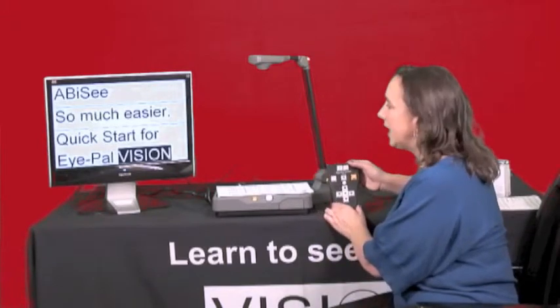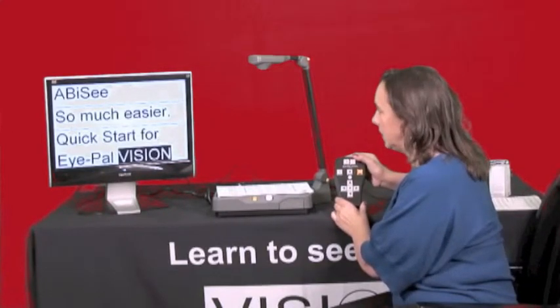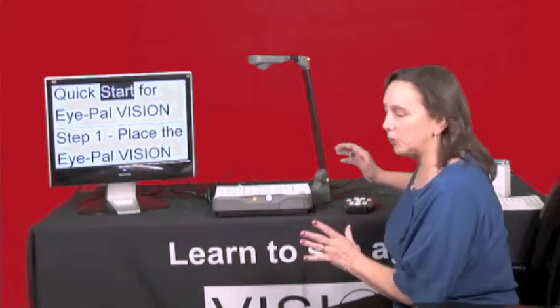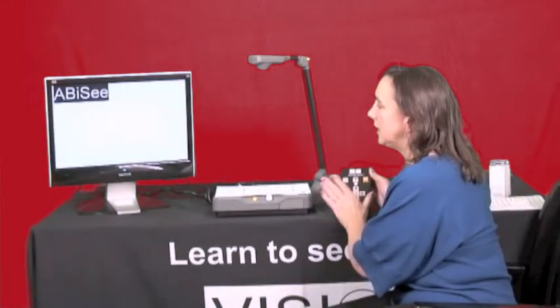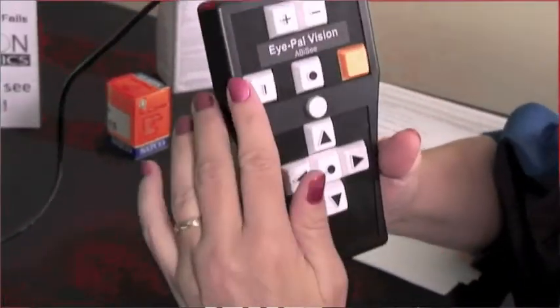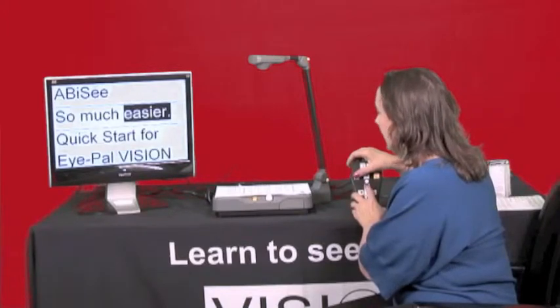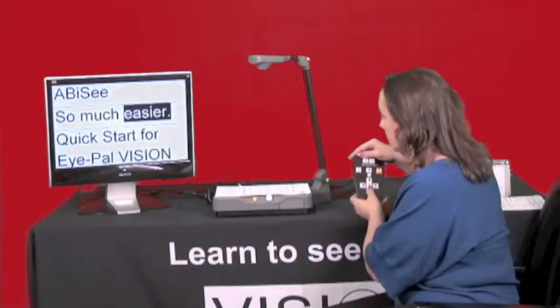The next feature I'd like to show you is how to save documents. You can save up to four images on your remote. First, place your document on the scanner bed and let it take the picture. Then your save button is around to the left — going counter-clockwise, it's a white square with a vertical line on it. Press that save button and any arrow — the image is saved to that arrow. Now you can continue listening to the reading.